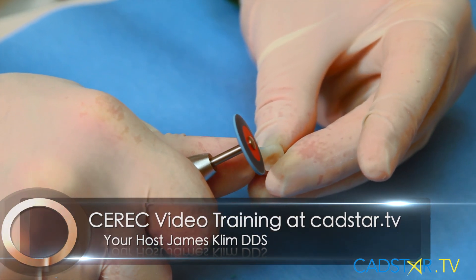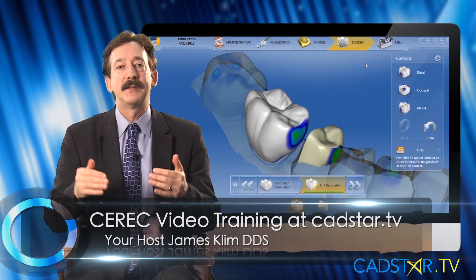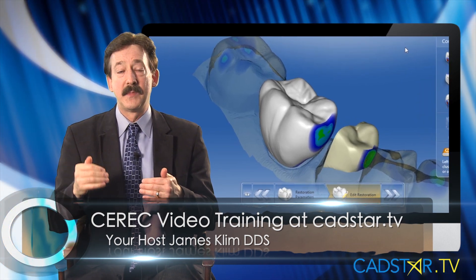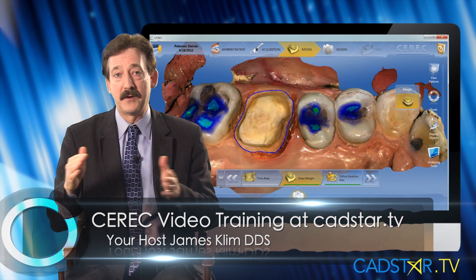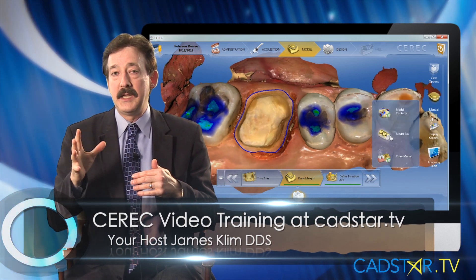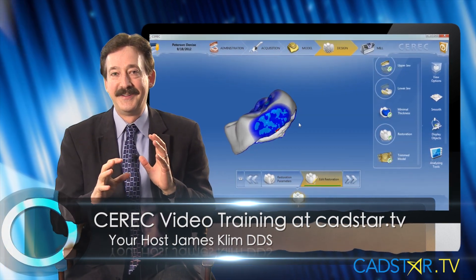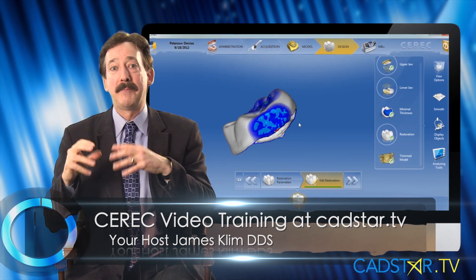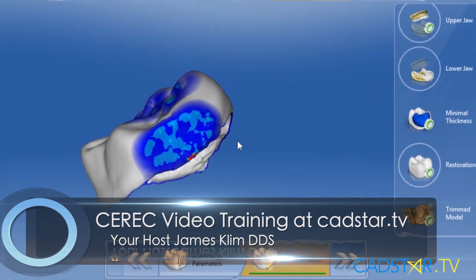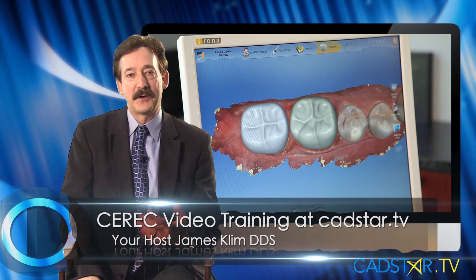I use a blue Meisinger wheel just to do a light polish on the contacts and it's perfect. My firmness color for blue cam is green, or slightly speckled green with my practice lab MCXLs. If I use OmniCam, it's a totally different color system. With OmniCam using the same milling units, I need light blue spotted on dark blue — that's more like negative 50 to negative 25.